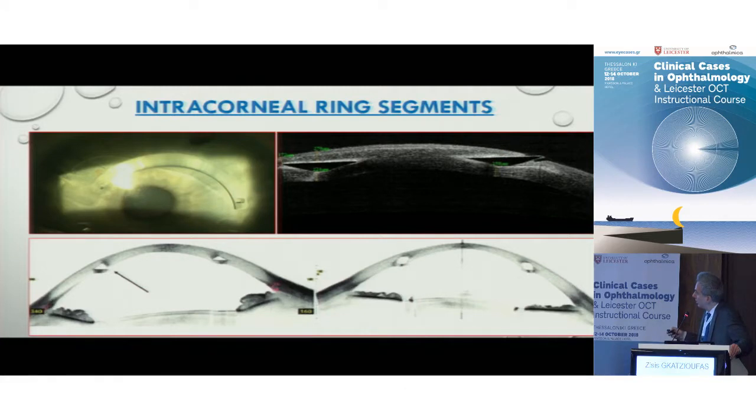And unfortunately, 9 months after the second procedure, we had a spontaneous explantation, protrusion of the Keraring. So this is a Keraring which has also been implanted inverted, as you can see here. So this should have been backwards, and the triangle configuration should have been facing forward.